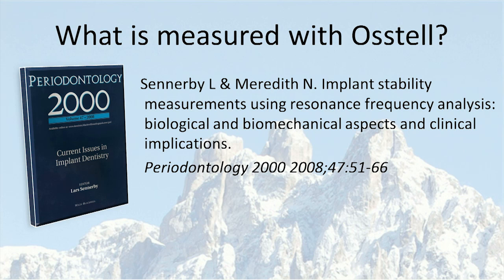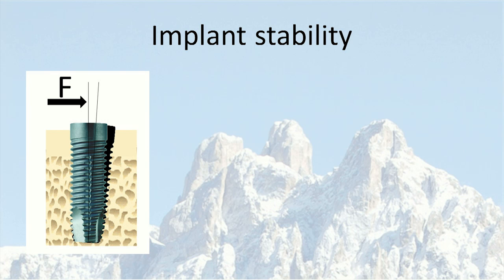Then, what have we learned during the 20 years? Well, it's a very short presentation this morning, but I can do some conclusions. And we have also been writing about this in this paper, which was published in 2008 in Periodontology 2000, which is a review paper on the technique. We know that implant stability can be measured then in different ways. It could be in rotational stability, it could be axial stability, and it could be lateral stability. And we are actually measuring lateral stability with the Osstell technique.